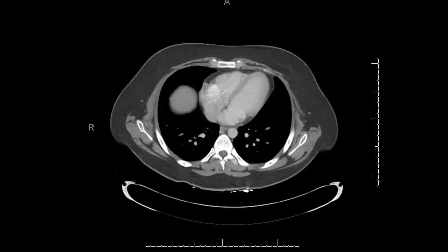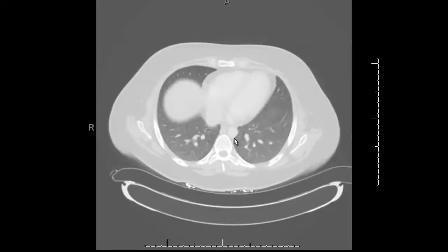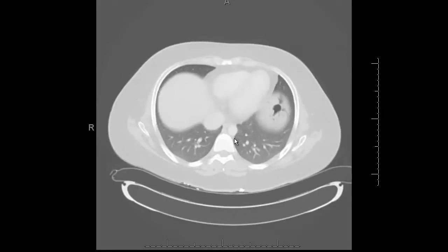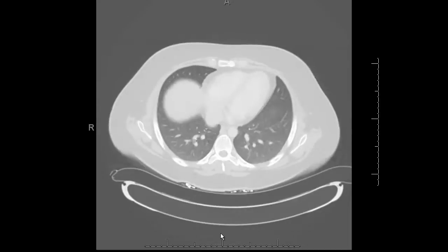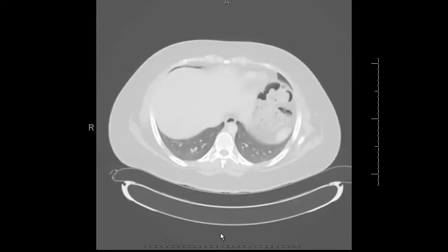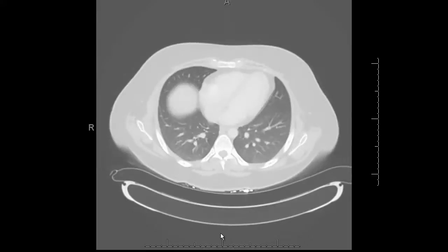I'm going to go over how I approach the abdominal and pelvic CT. To start, I look at the images on lung windows — you can modify the lung windows with your keyboard, and different people have different settings. On lung windows, I'm looking for pulmonary nodules, scrolling down and sometimes using MIPs to find any nodules on the thin cuts.